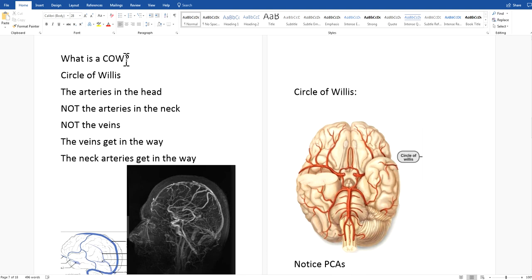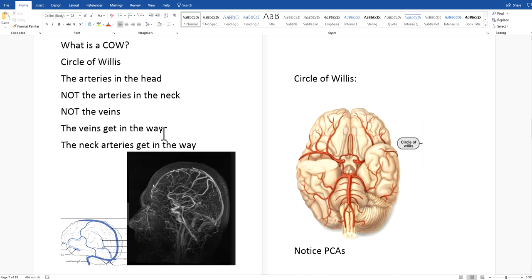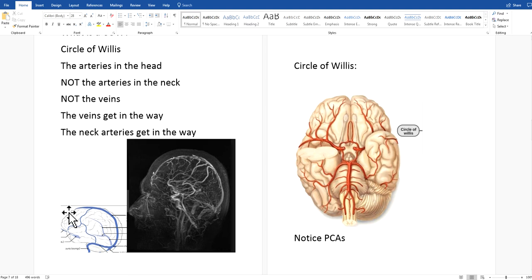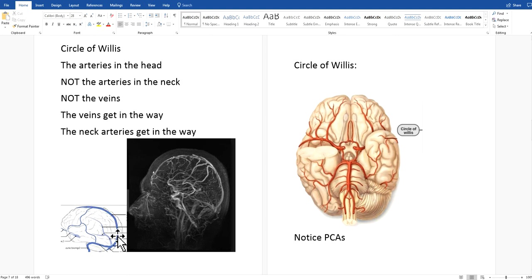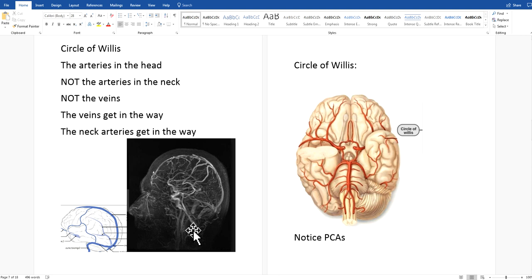So what is a COW? COW stands for Circle of Willis — C-O-W. It's the arteries in the head. It is not the arteries in the neck, and it is not the veins. The veins get in the way of a good COW picture, and the neck arteries get in the way too. These are examples of the veins in the head — the dural venous sinuses and the deep veins in the brain. We can't film out a COW with all these veins in the way, or we won't be able to see the arteries.